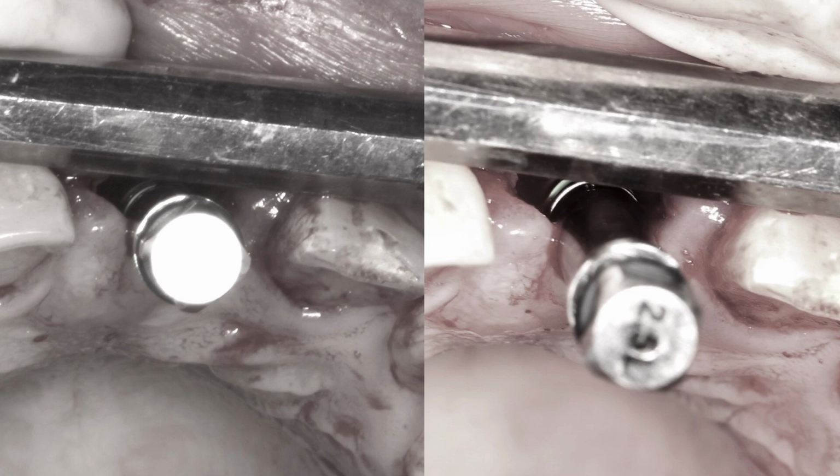And do understand, because the bone is relatively soft in the maxilla, this is available and possible to perform in most situations. It just requires a lot of careful manipulation and the careful clinical skills to be able to do this without necessarily making the osteotomy site be so large the implant loosens.